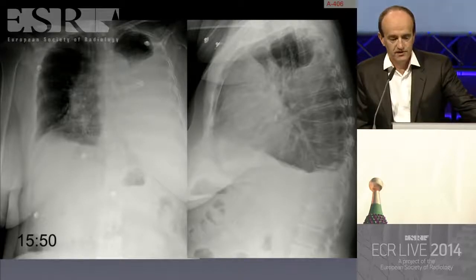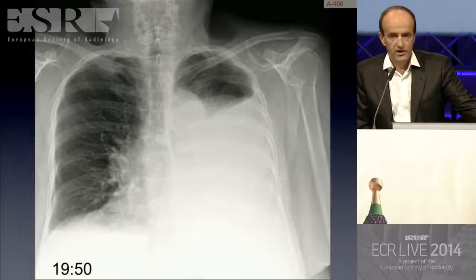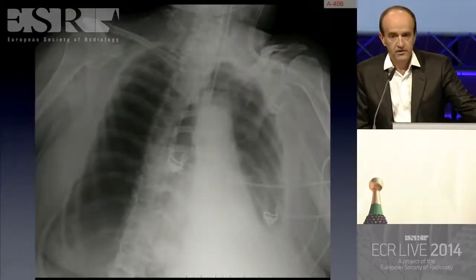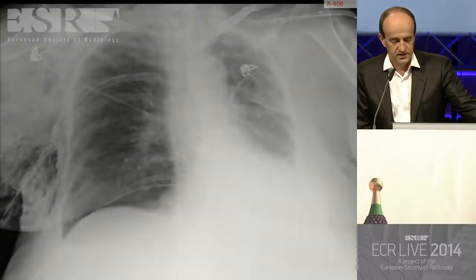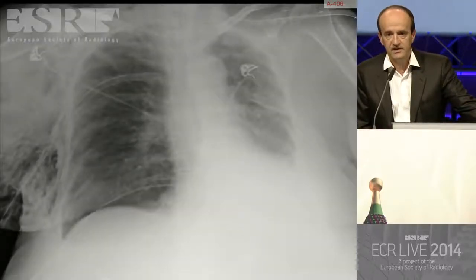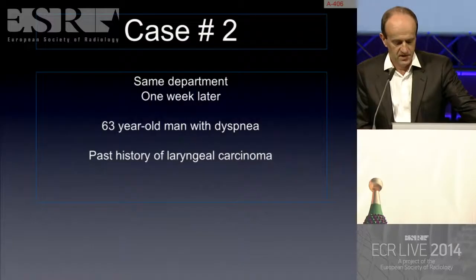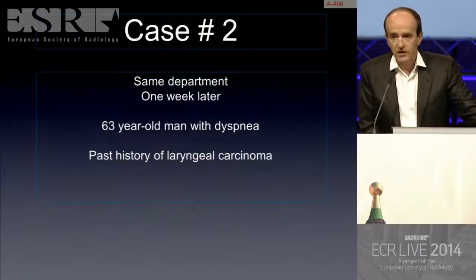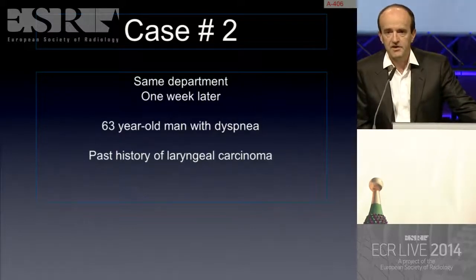This is the correct radiograph. What happened? A pneumothorax appeared on the right. The patient had to be intubated and stayed for 10 days in the intensive care unit.